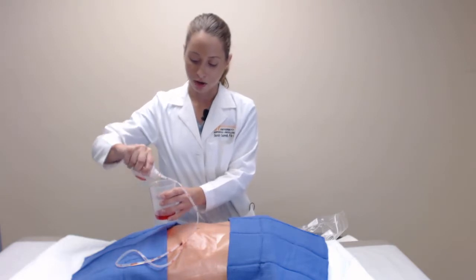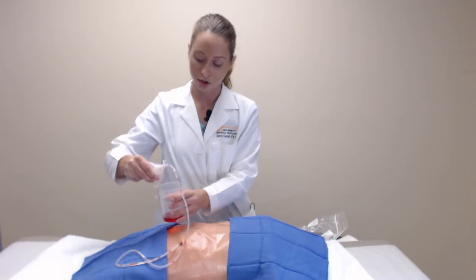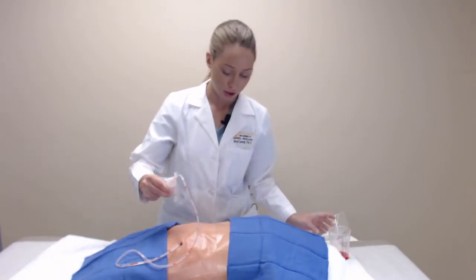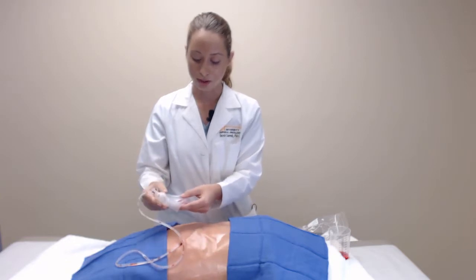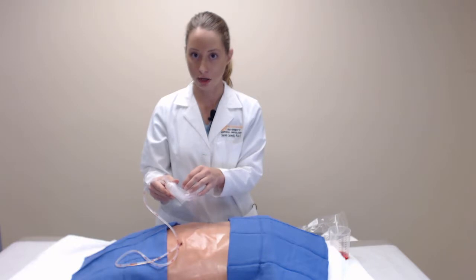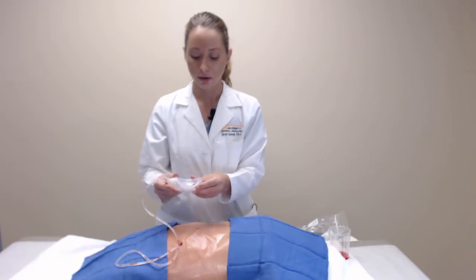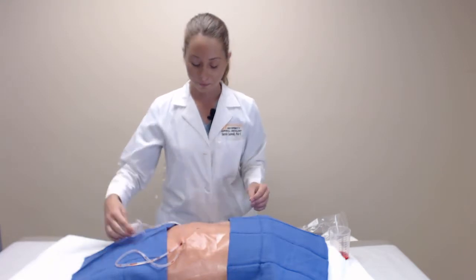Before putting the top on, you want to make sure you squeeze all the air out of your drain bulb using the palm of your hand, and then put the top back on. It's important to get all the air out of the drain bulb itself so that you maintain the vacuum nature of your drain. Essentially, it should look as if you could sit a tennis ball in your drain bulb.